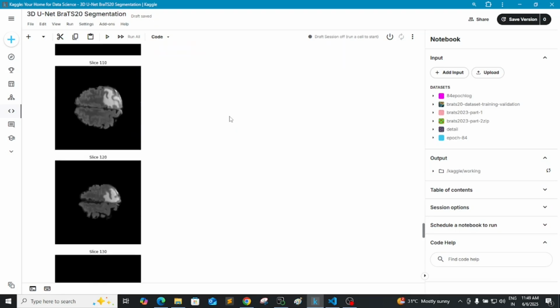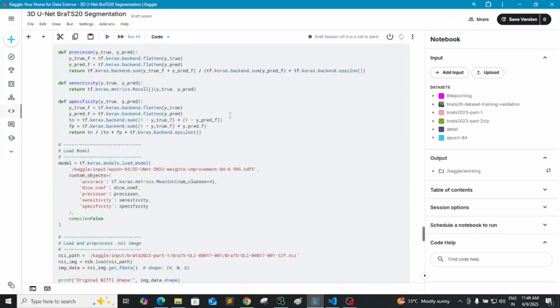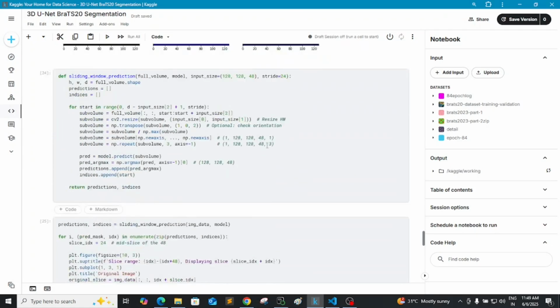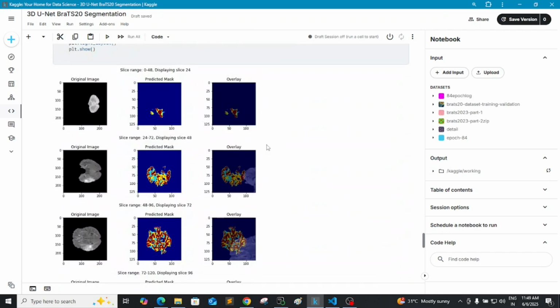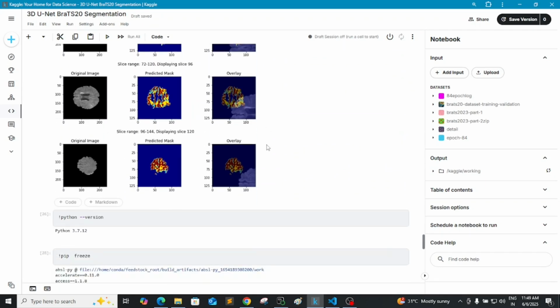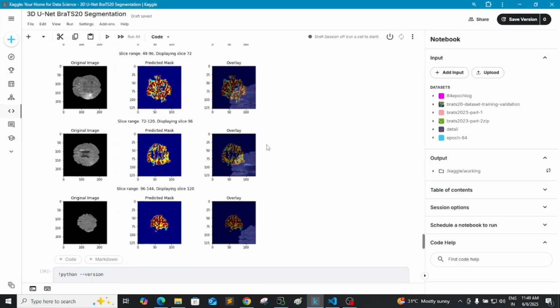So like this, one brain is captured in all angles. If you upload a single slice of the 3D brain, you can get a result like this. So when the brain moves or rotates, according to that we can find where the brain tumor is. Is that clear? So this is a way to handle the data.